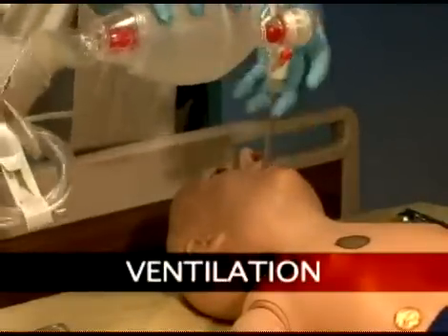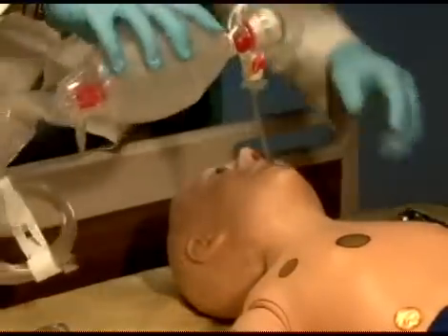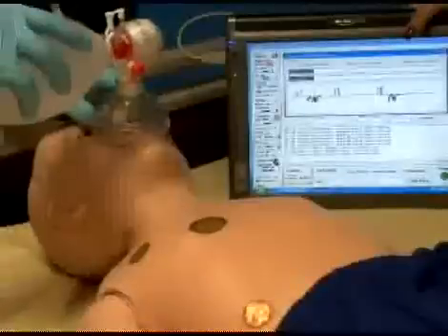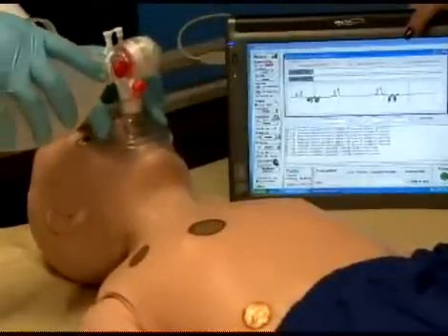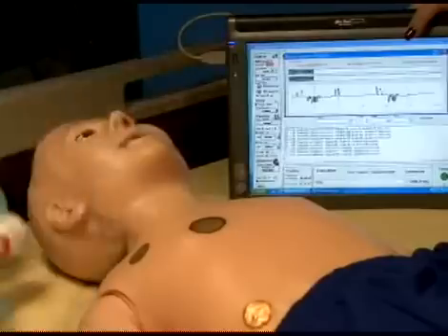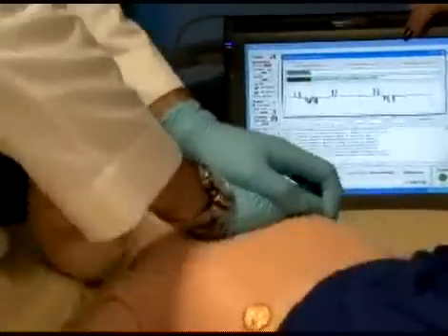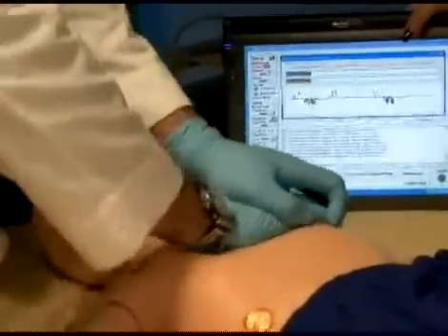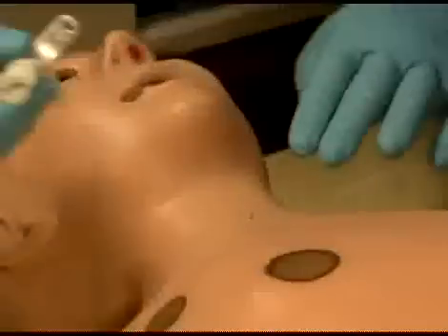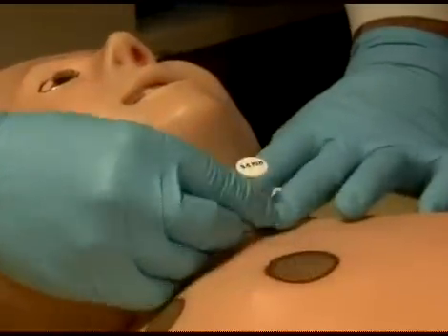Additionally, pediatric HAL can be ventilated with a BVM or mechanical ventilator. Ventilation and manual chest compressions are measured and logged, showing the instructor exactly how students are performing.